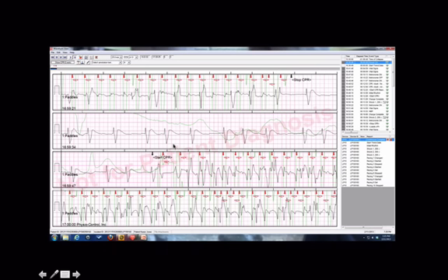The LifePak will only record this information if it is set to paddles mode. If you change it to a different lead to check for fine VFib or something, and you remember, please change it back to paddles or else we're unable to collect the information. If you're not familiar with what I'm talking about, that's okay. It usually defaults to paddles mode, so you should not have to worry about that unless you're actively changing it.